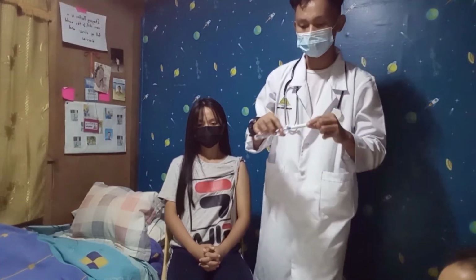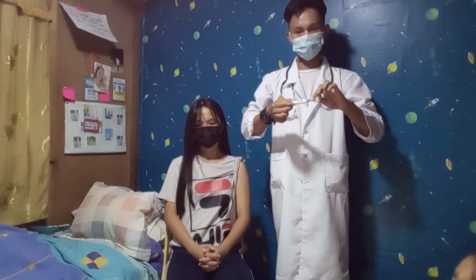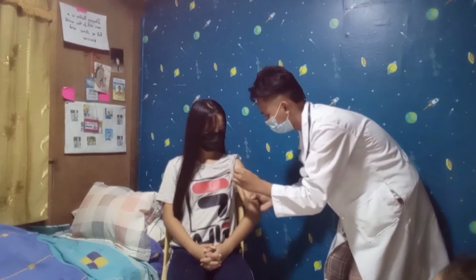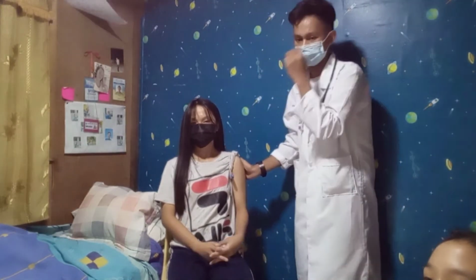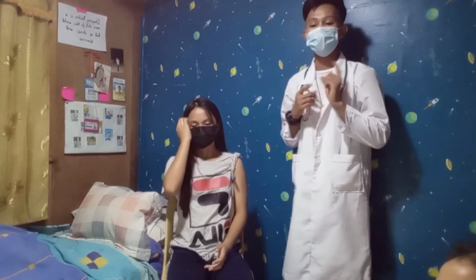With the cotton ball, wipe the thermometer using a rotating motion from the temperature sensor to the neck. Place the thermometer in the patient's axilla. Assist the patient to place the arm tightly across the abdomen to keep the thermometer in place, and wait until the thermometer buzzes.